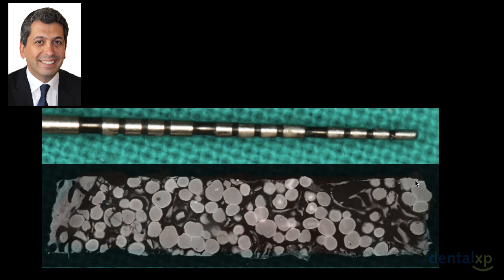In cases like this, you can be more confident about the biomaterial you use, because it is a biomaterial that could achieve its properties. And the main property of a biomaterial is to maintain the volume stability. This is why we need a biomaterial that will not resorb immediately. And you can see that we have a volume stability in this biopsy.